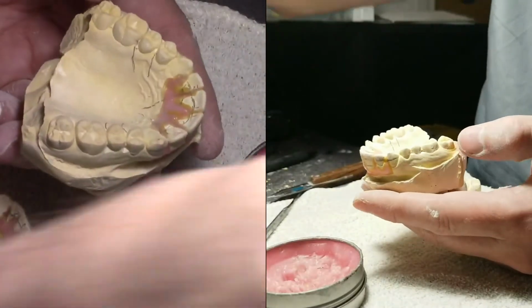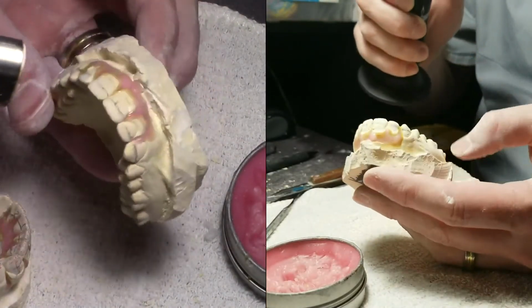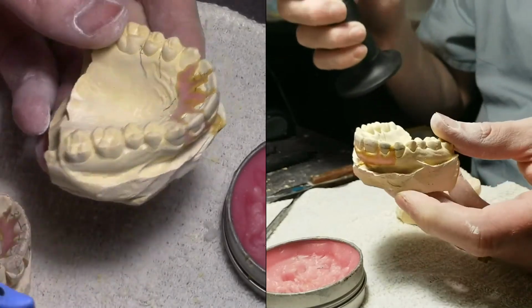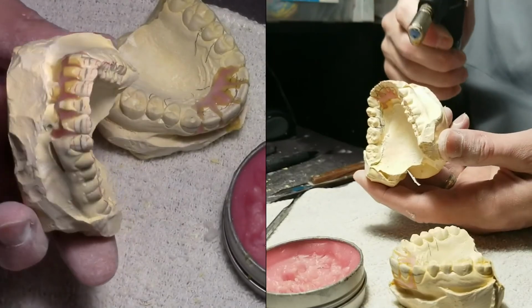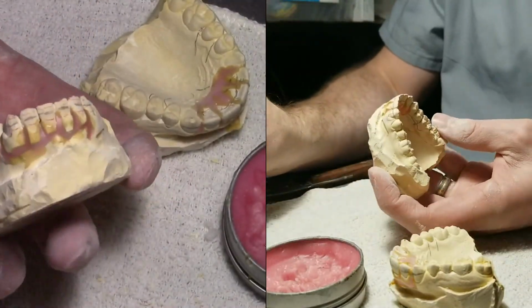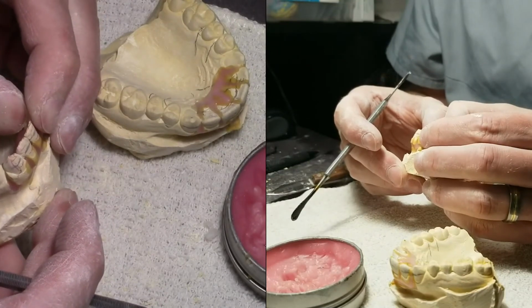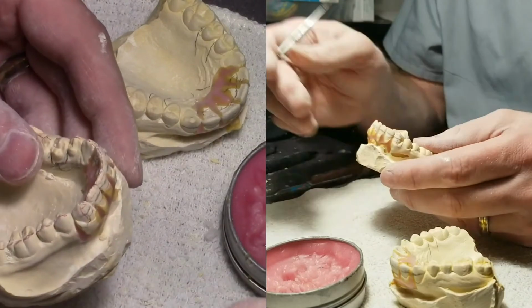Sometimes what I like to do is I'll take a little bit of a flame, shine up the wax, just to make it look nice. Smooth it out some. I actually need to build here. We're trying to rotate this one tooth. There we go.